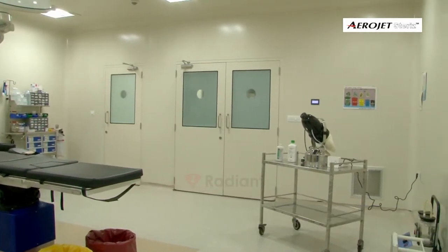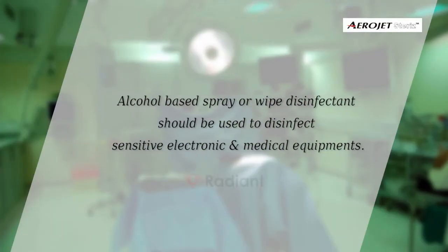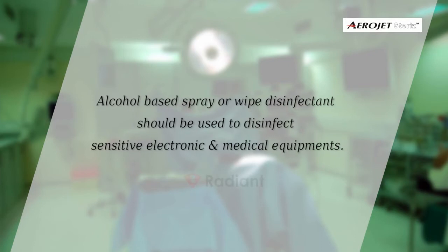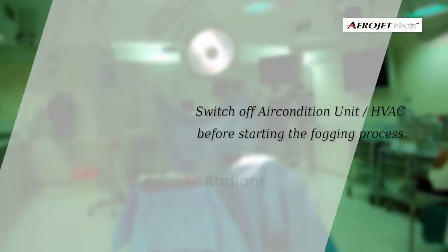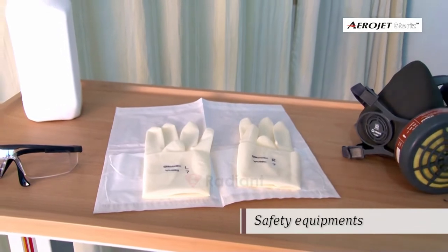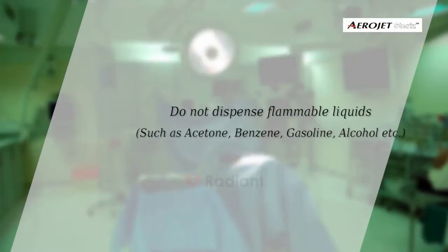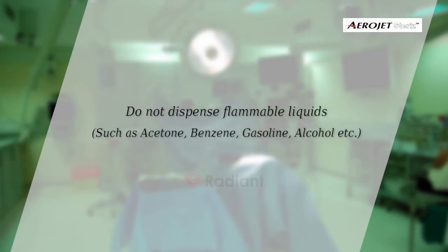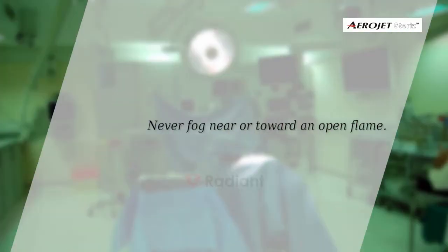Wipe with recommended disinfection solution. Alcohol-based spray or wipe disinfectant should be used to disinfect sensitive electronic and medical equipment. Always switch off the air conditioning unit before starting the process. Use necessary safety equipment as recommended by the disinfectant label. Do not dispense flammable liquids such as acetone, benzene, gasoline, or alcohol.